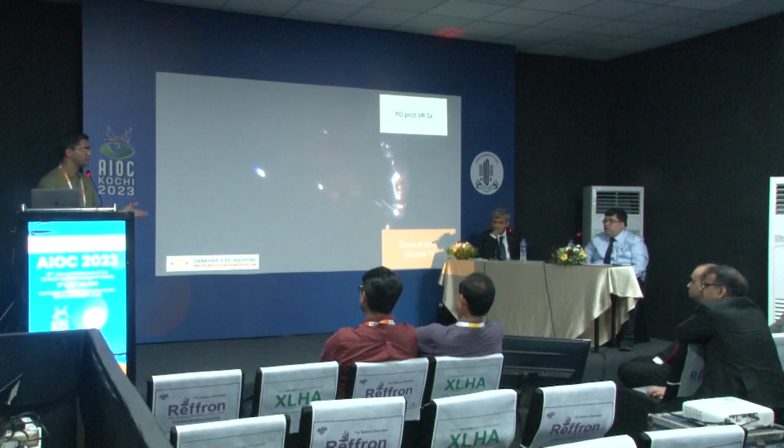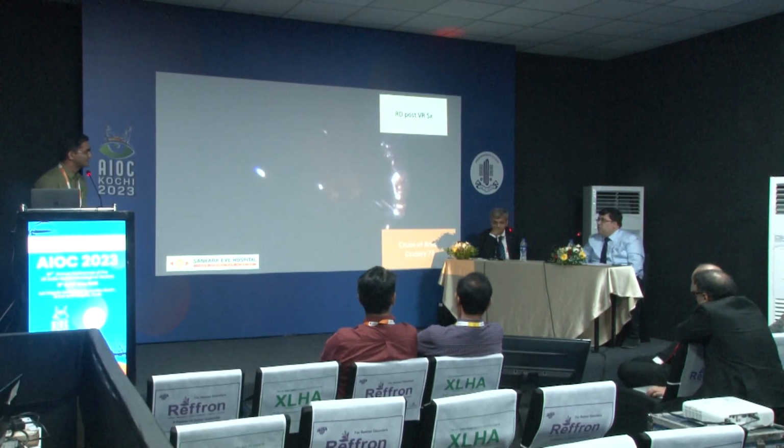Yes, obviously we couldn't see the video right now. See, aggressive cautery, especially when you still need to tackle membranes around it, will make that retina weak, and then you're doing a lot of dissection around it. The break will keep enlarging. So as Dr. Vishali was saying, avoid cautery or use minimal cautery, especially in the areas where membrane dissection still needs to be done. We probably could have avoided it.